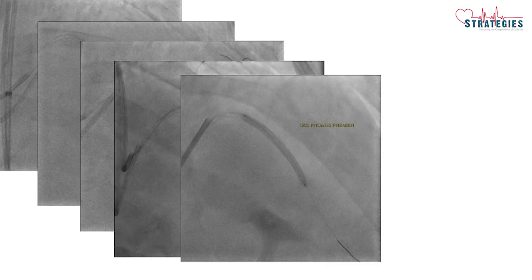So that's why I placed an antegrade wire into LAD, and then we removed the retrograde wire, and then I checked septal from Caravel just to see if there are any injuries in the septal collateral. There was no injury in septal collateral. So then we started stenting LAD.